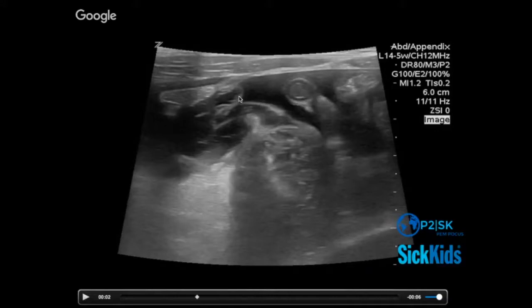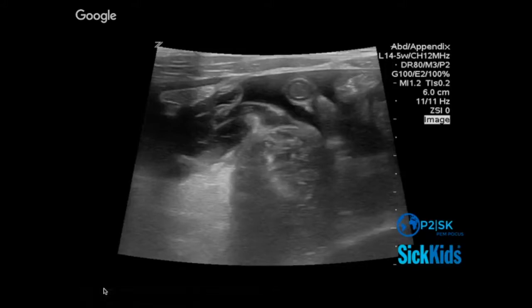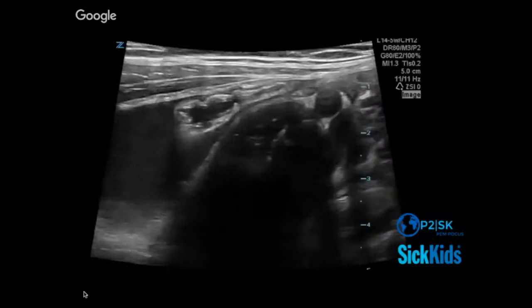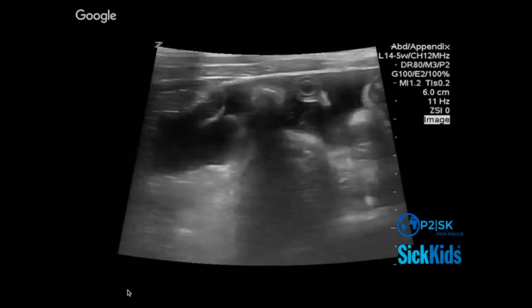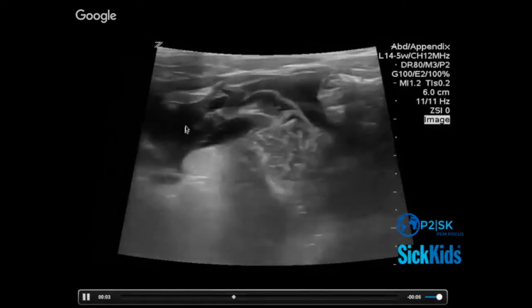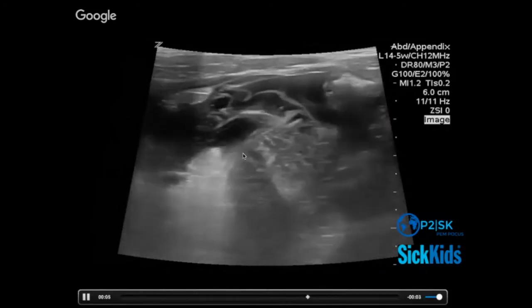What is all this? Could be ileus. Kind of has a not so convincing bowel appearance. So I don't know for sure. These are the ones where things get tricky. But this is also what a phlegmon can look like at the start.